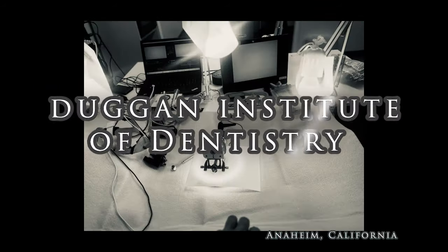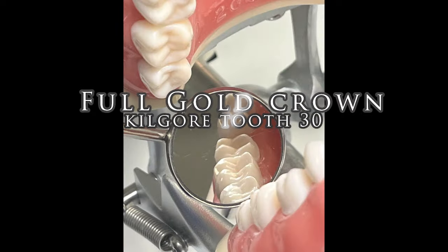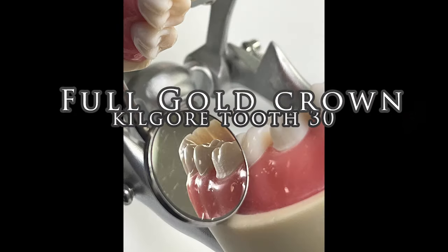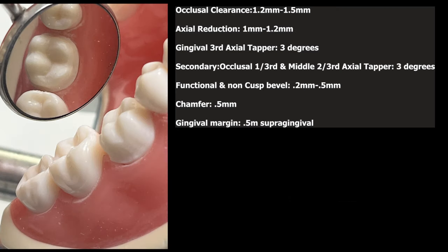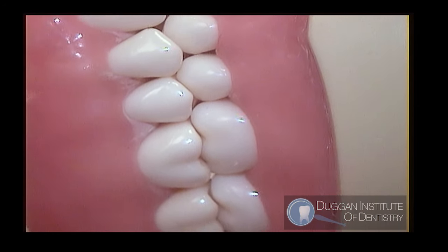In today's video, I will be demonstrating the full gold crown performed on Kilgore tooth number 30. The burr we are using for the occlusal reduction is the 55 carbide Fisher burr. You may also use a 56 or a 57 carbide Fisher burr.